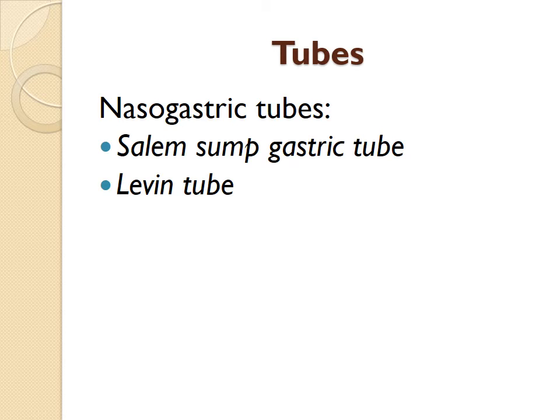Now, I just want to take a moment to mention a few other tubes that you may see. Unless you're in a specialty area, you may not see these as often. They're not used as frequently as they used to be because patients do tend to go to the OR with different situations much faster. But some of them are. The first is called the Ewald tube, EWALD, and it's used to irrigate and clean out or flush the stomach with certain overdose victims.